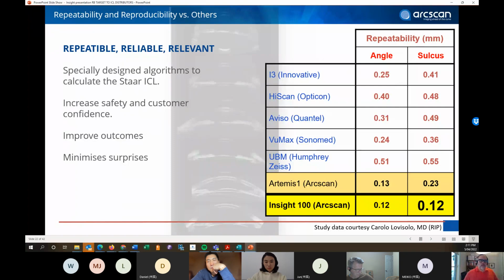And if we choose the wrong ICL and we induce more angle closure, that's it. That patient will have a problem, and I think the doctor may lose their license. I think this table is good material for us to talk about with the physician. And yes, I'm sure of that.